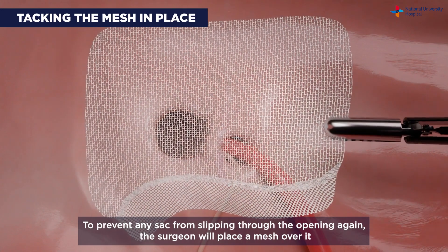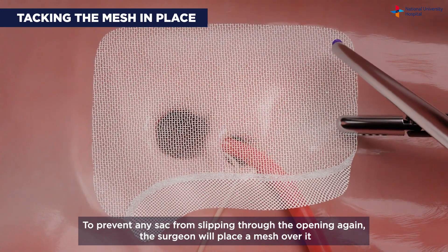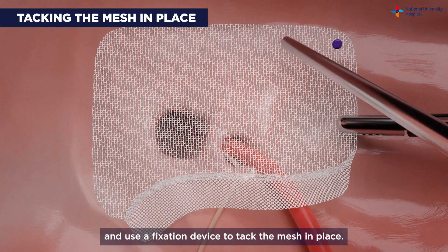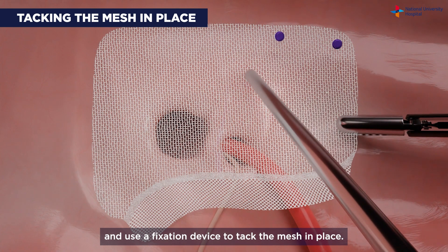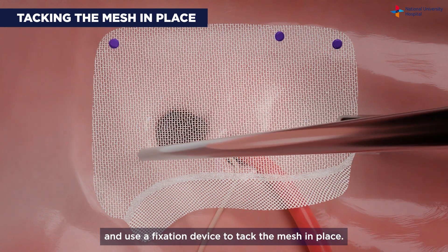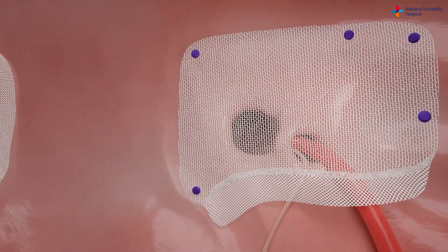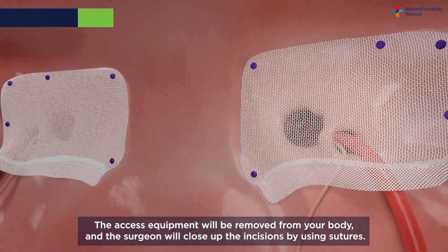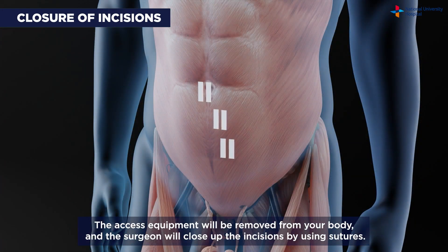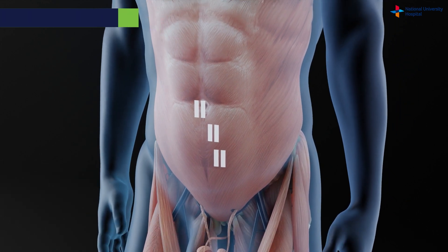To prevent any sac from slipping through the opening again, the surgeon will place a mesh over it and use a fixation device to tack the mesh in place. The excess equipment will be removed from the body, and the surgeon will close up the incisions using sutures.